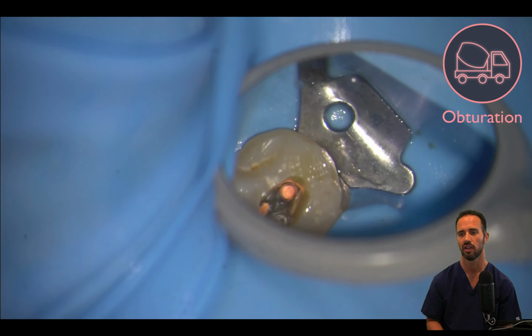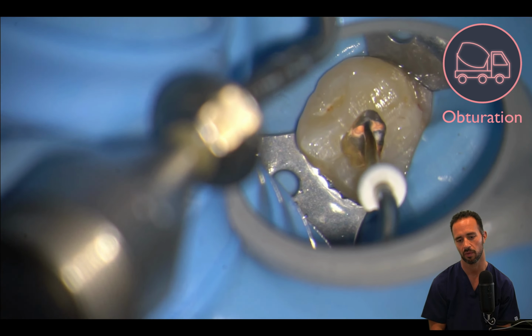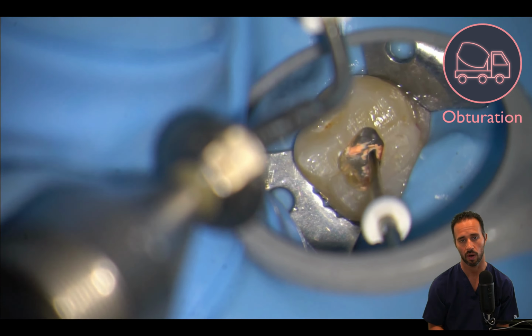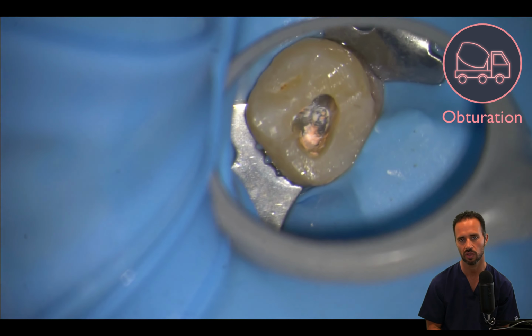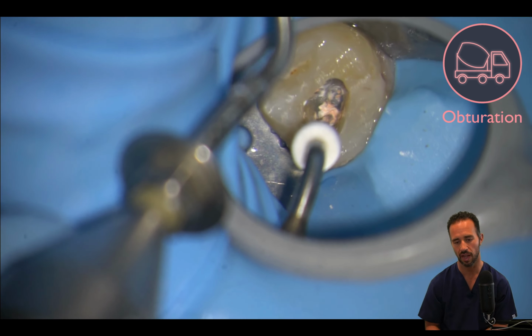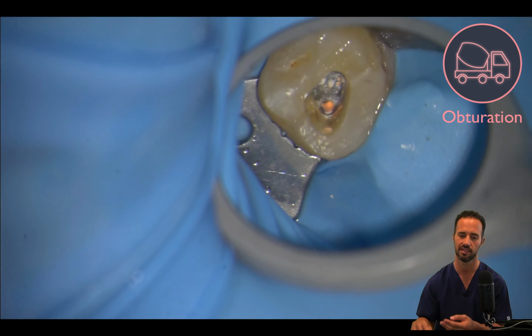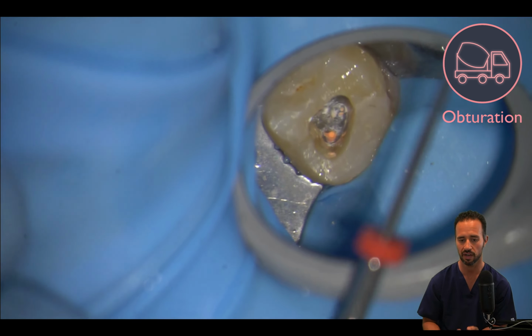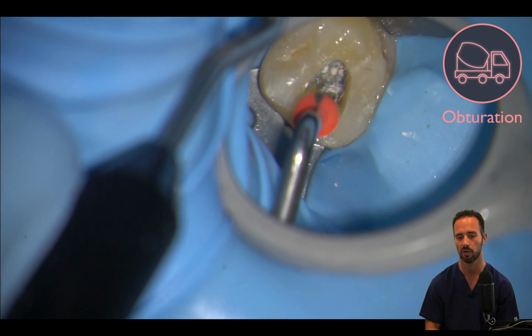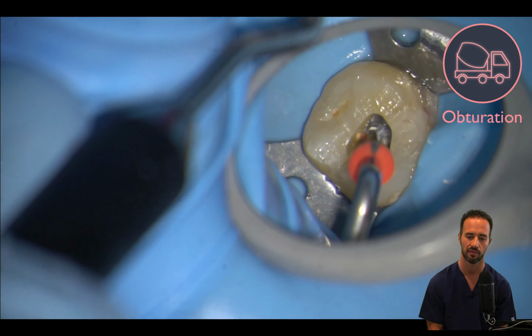And as usual, if it were me, I would go ahead and place a core buildup right here while the rubber dam was on, while the patient was already here. You're going to save the patient an extra return visit to your practice. You're going to save yourself a lot of chair time, and you're going to be ultra productive by being able to perform both your endo and your core buildup all at the same visit.